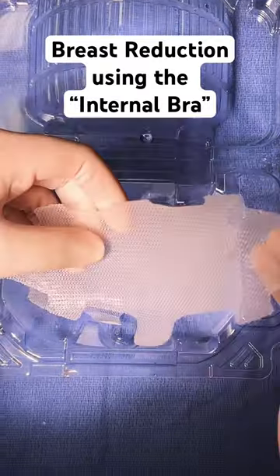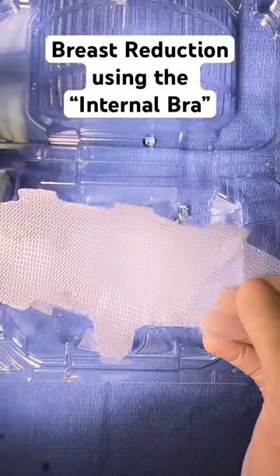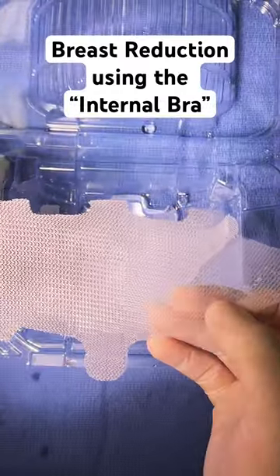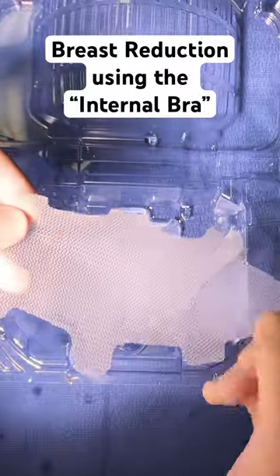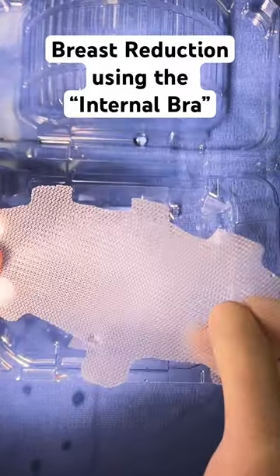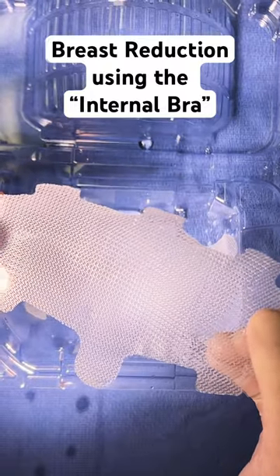This is our piece of Galliflex surgical scaffolding that we're going to be using today. We're doing breast reduction, bilateral. We've chosen the shape piece — it does not have the rim because I wanted to contour to the pedicle of the breast. We're not placing it with implants.